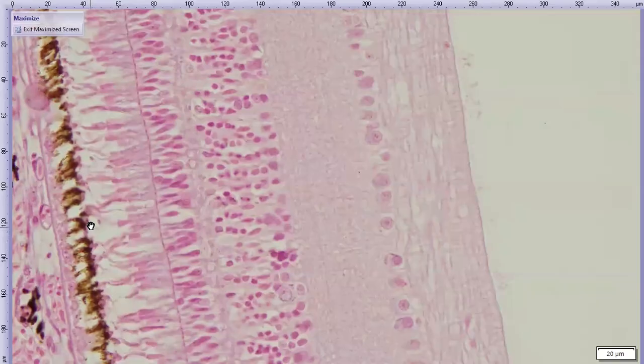I'll show you some perhaps better specimens, but I think even with this, if you're used to looking at dog, cat, human or mouse retinas, you can see how robust that pigment is and how it actually migrates up and shades the photoreceptor outer segment. So I call this phenomenon the shading of the photoreceptors. And once again, you should expect to find this phenomenon of shading of the photoreceptors in every vertebrate taxon except mammals and snakes.